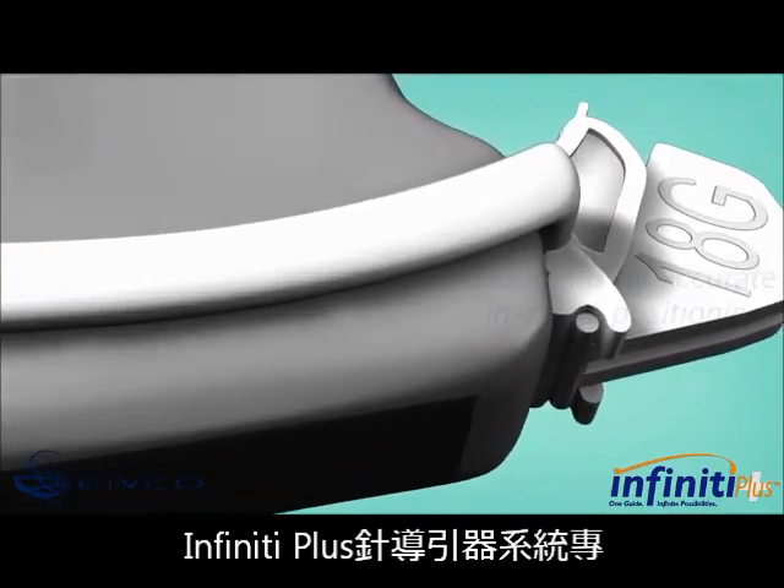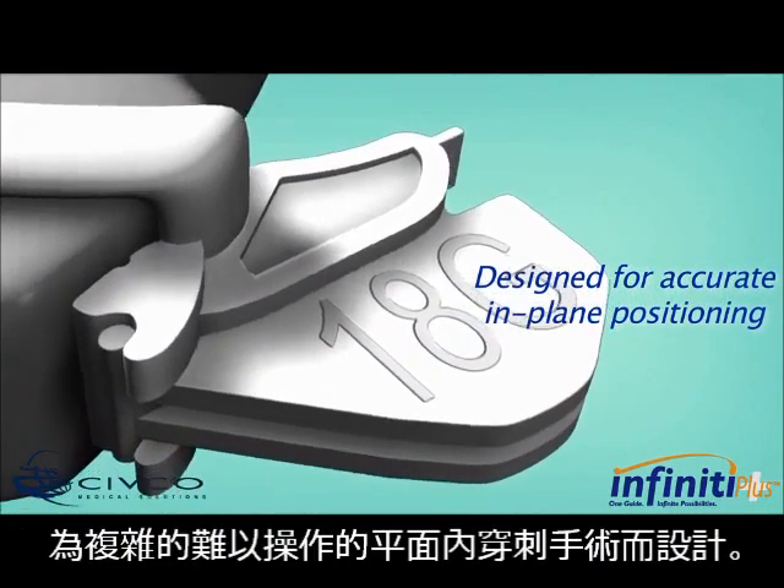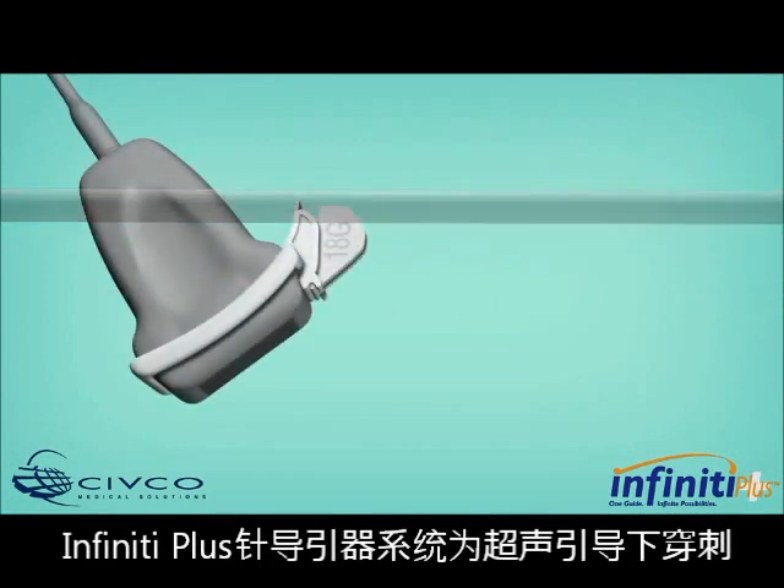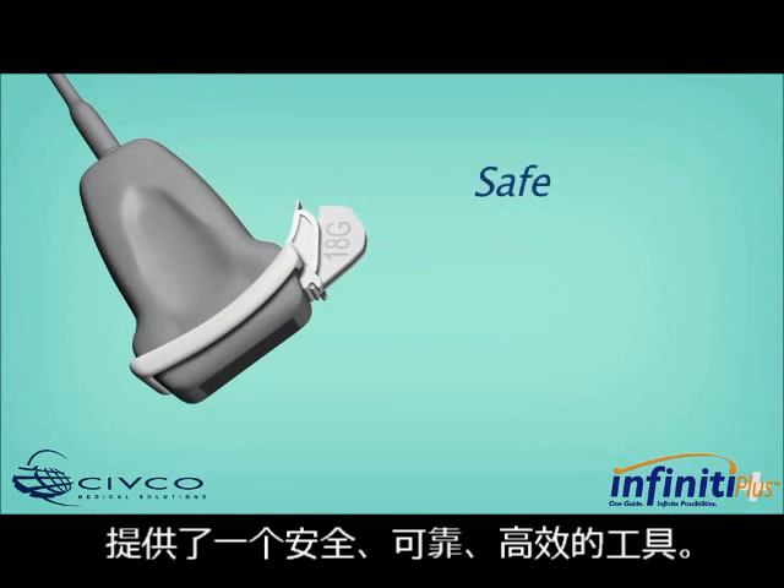Infinity Plus Needle Guides are designed for accurate in-plane positioning during procedures where access is difficult. The Infinity Plus Needle Guide provides a safe, reliable, and efficient tool for ultrasound-guided puncture procedures.